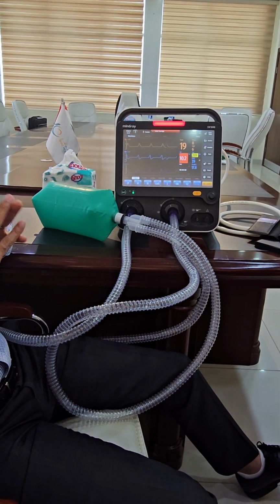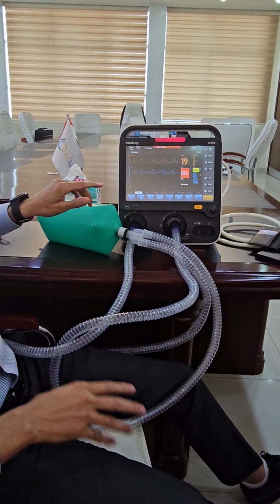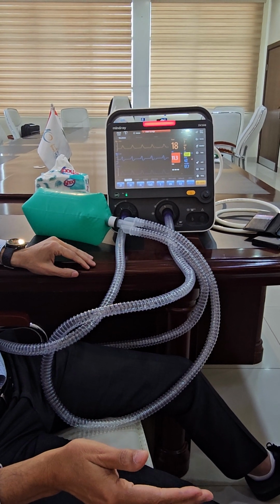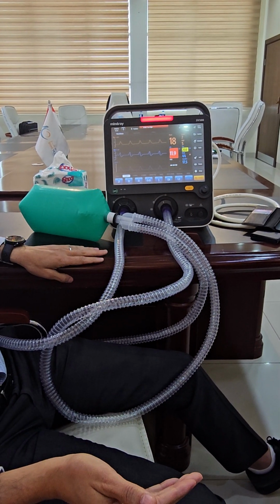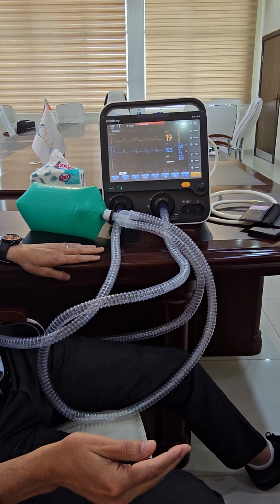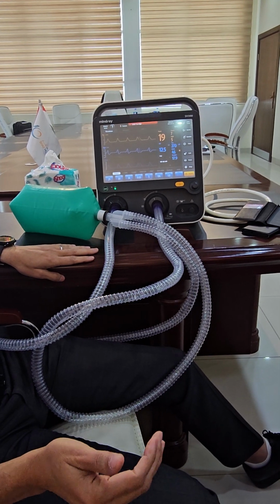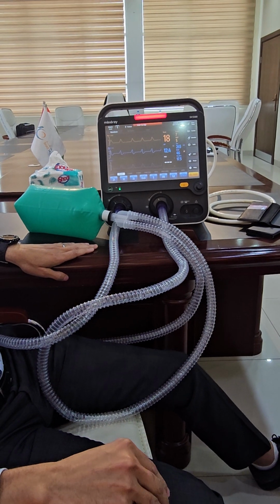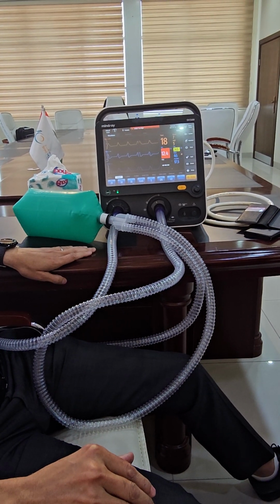So we understand the V and P, right? And then we have the phase variables, that change the ventilator from inspiration to expiration and pauses. So: start, sustain, and end. And then we have the conditional variables.